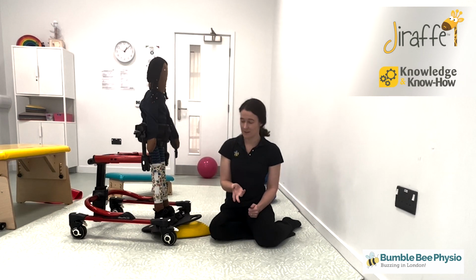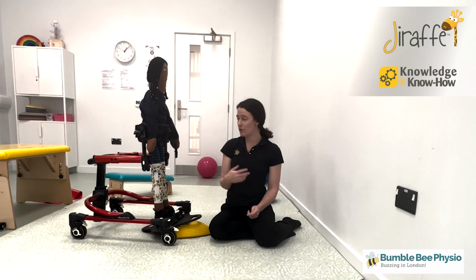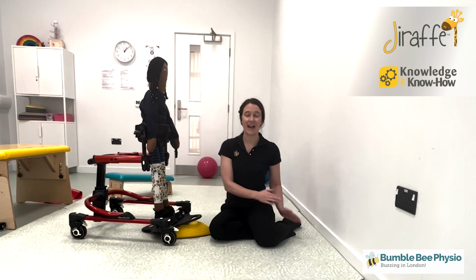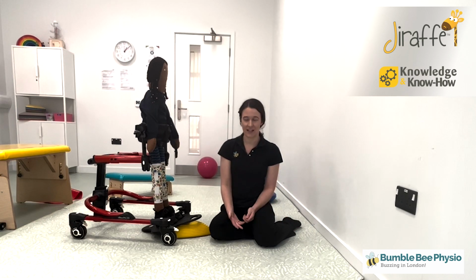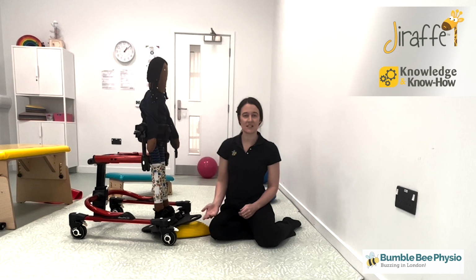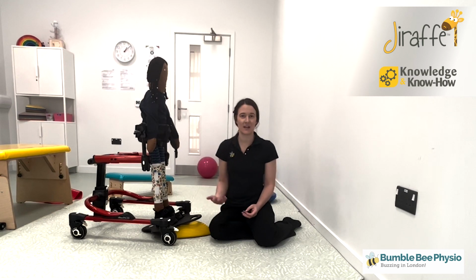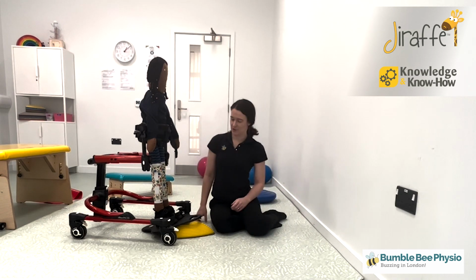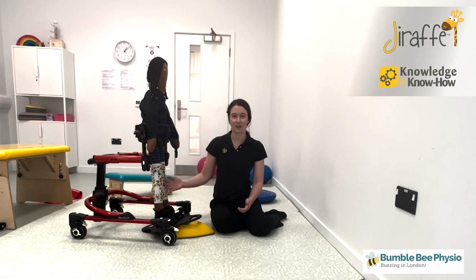So in order to combat this, not only do we want to actually stretch that muscle by isolating both knee extension and dorsiflexion, in addition to that, we want to do it dynamically and actively if we can for an even better stretch. Once we've got these things under control and we've got the ability to do these things, we can do that stretch for much less time during the day, because it's going to be much more effective than a passive stretch. So here I'm using gaiters, which helps with the knee extension.